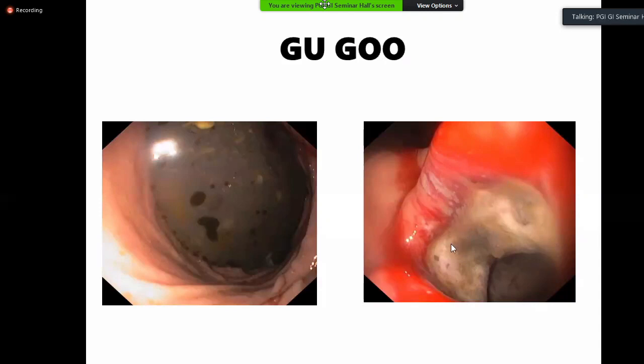This was a large ulcer in a non-steroidal anti-inflammatory agent induced ulceration, with gastric residue. So in any patient with ulceration, you have to define whether the stomach is distending normally, whether there is any residue present or not. Presence of residue means that there would be associated gastric outlet obstruction, whether symptomatic or not. You can even pick up asymptomatic gastric outlet obstruction by the presence of residue.